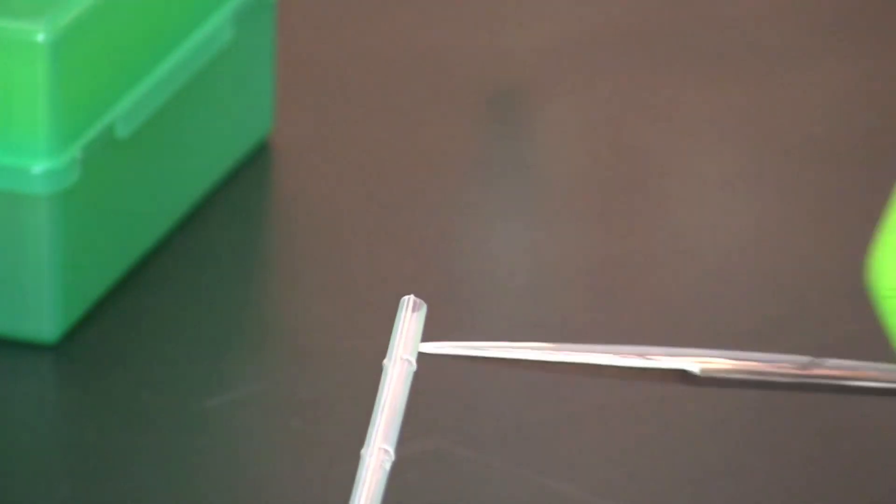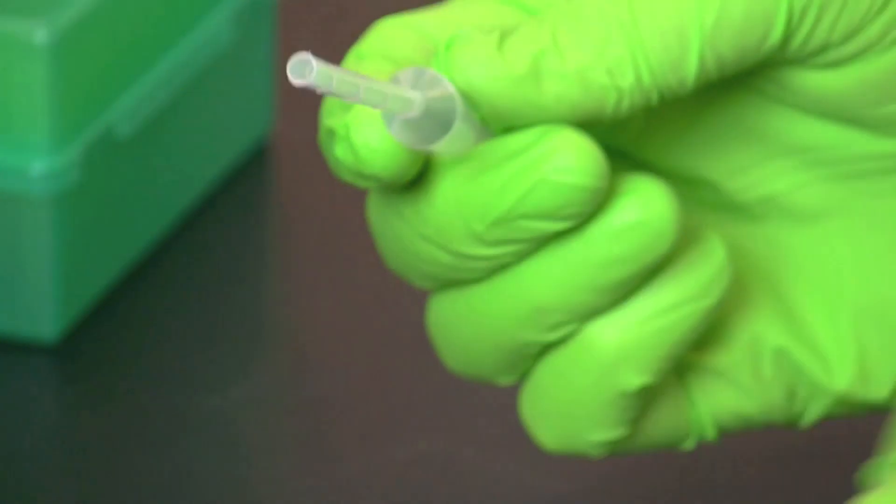Once cut, the pipette tip will be used to puncture holes out of the agarose to prepare the assay plate.